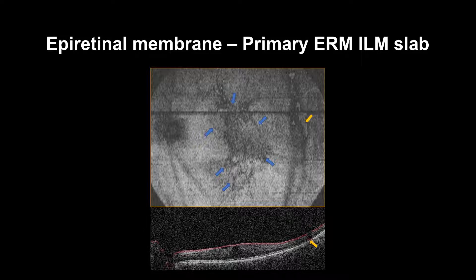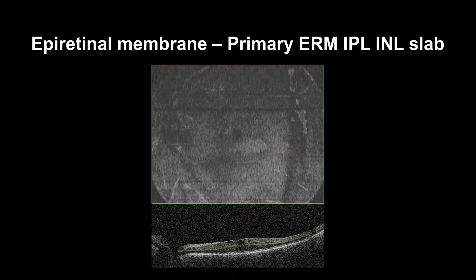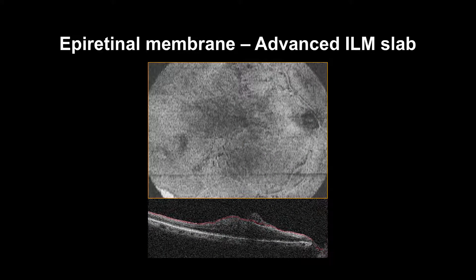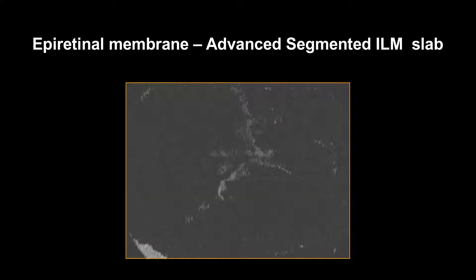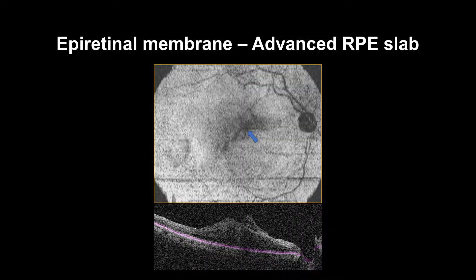Please note the masking and blink artifacts. The IPL-INL slab will show mainly the intraretinal cystic changes if they exist. In some cases, segmentation adjustment is needed to reveal the true extension of the epiretinal membrane. In some severe cases, the epiretinal membrane will induce projection artifacts on the RPE.